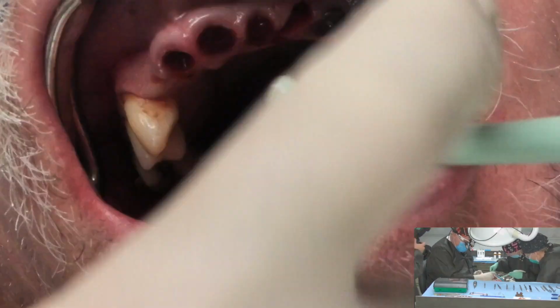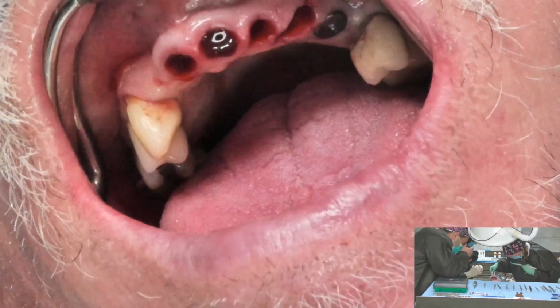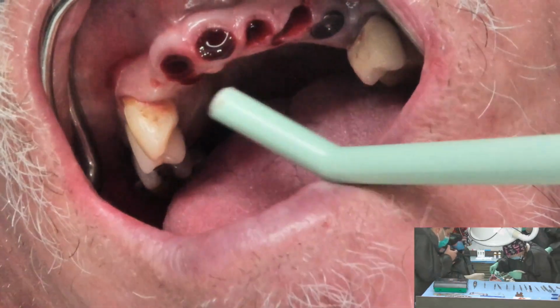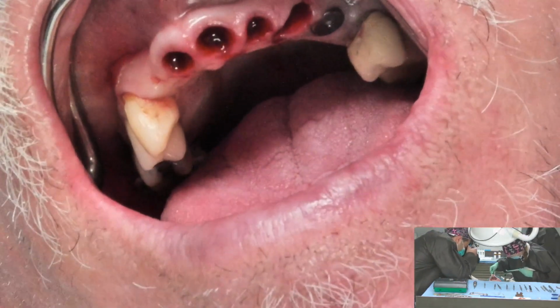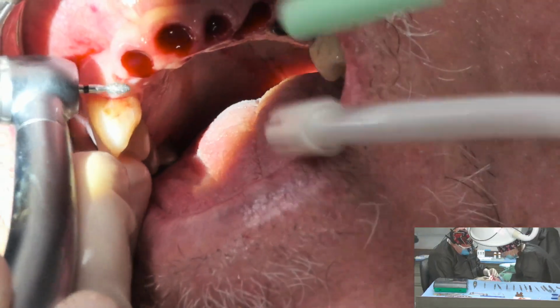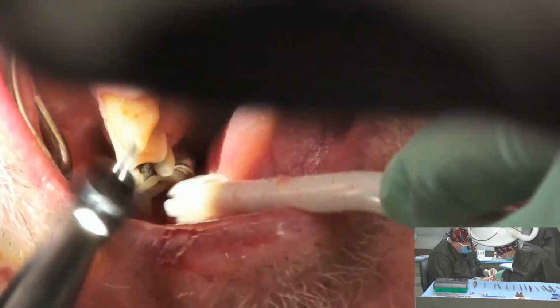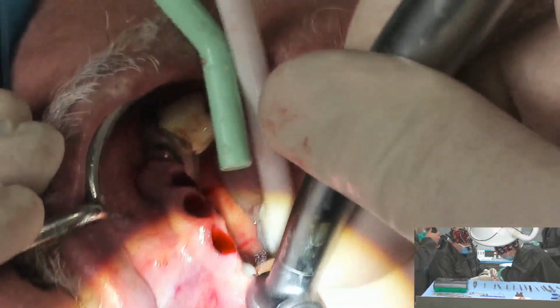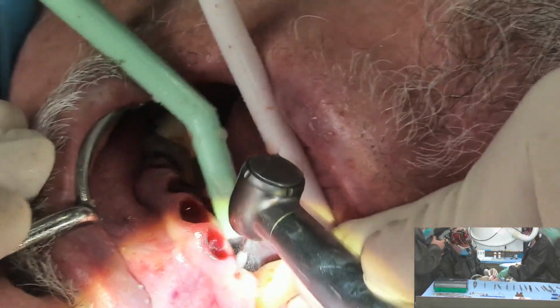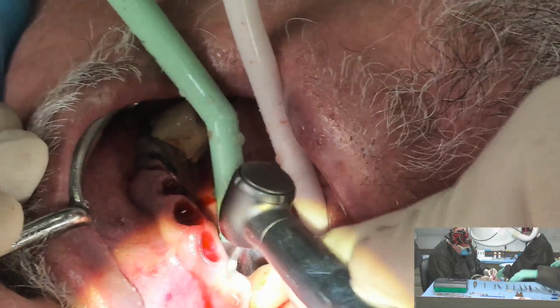Come closer. You should be able to go right into here, Jenny. You should be able to get really close, like one-to-one. I'm going to put that there. Great. Okay, so now what I'm going to do is continue along here, and we're going to be creating in the tissue an extraction socket. We've got 4 extraction sockets. So what I want to do is keep being synonymous in my plan of attack here.